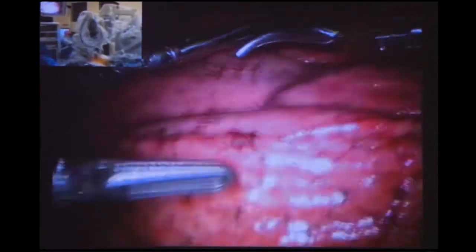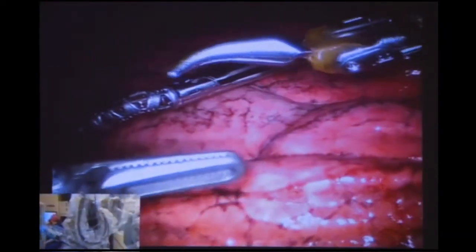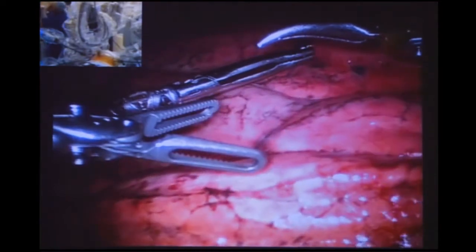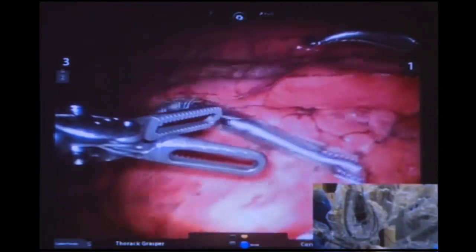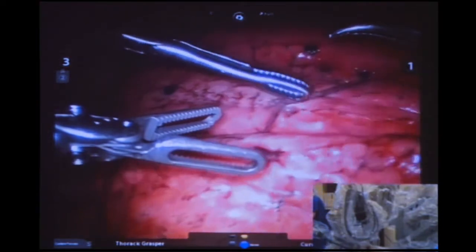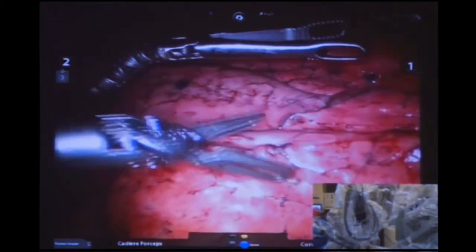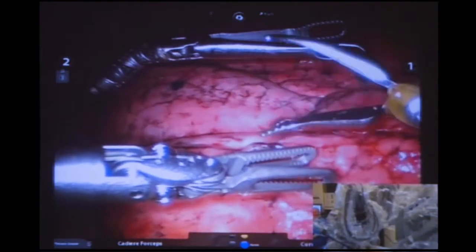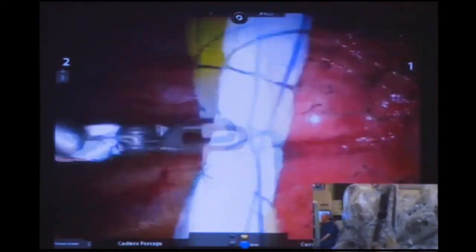Let me show you the instruments. In port three we've got the lung grasper — it's a quite delicate, small instrument, really good for gently pushing the lung away. You can either push or grasp very gently and it doesn't cause much damage. We've then got the cadier, another gentle instrument. And then we've got this curved bipolar, which I can use to give energy, dissect, and get around vessels very nicely.